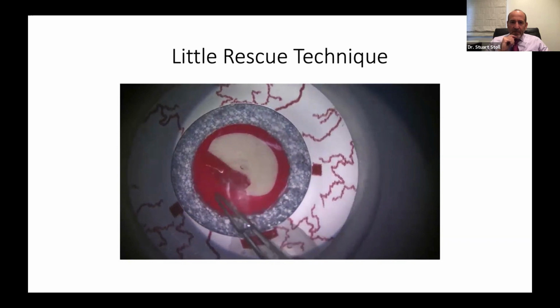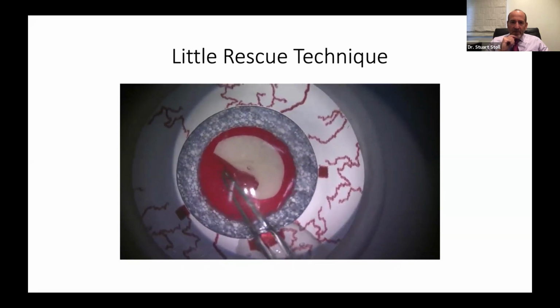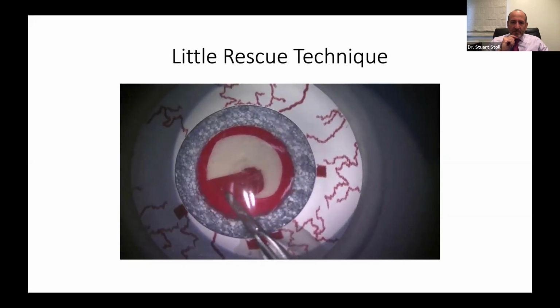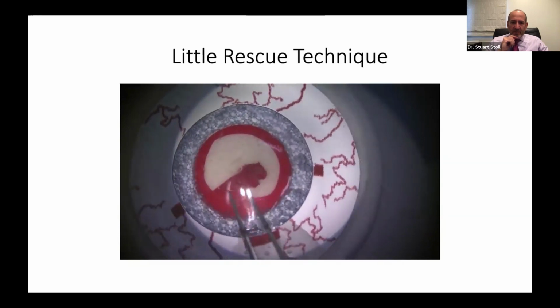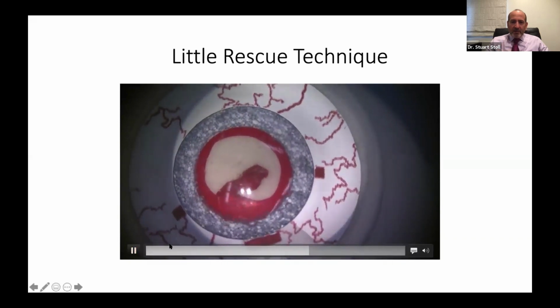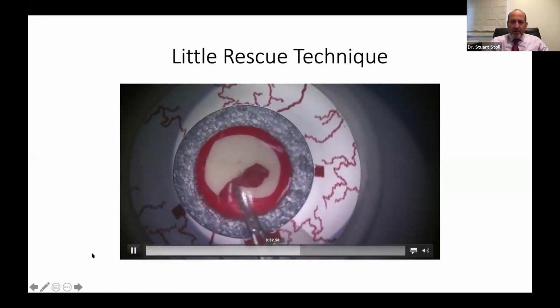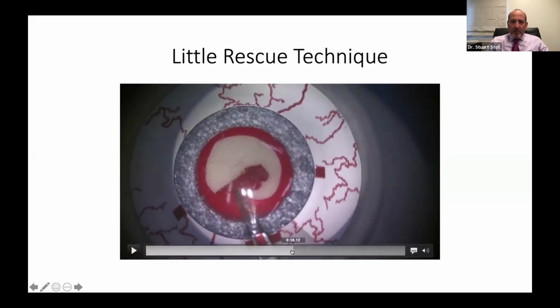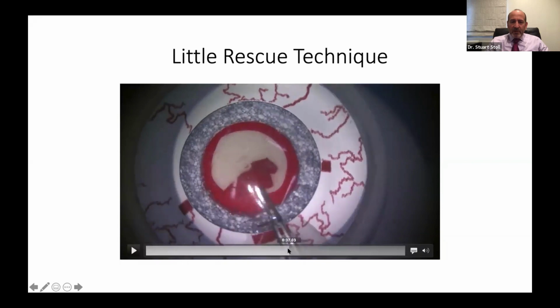So now we're going to continue along, right? Tension's off, now tension's on, continuing around, struggling a little bit. Oh, what just happened there? My goodness. So let's back up and see what happened there. It's a subtle mistake, but watch what happens.